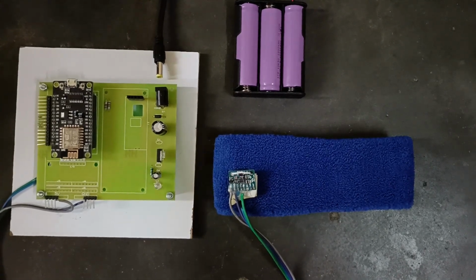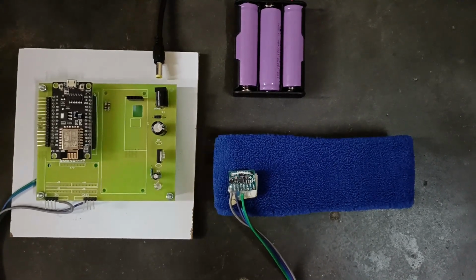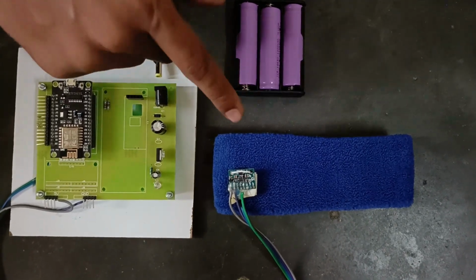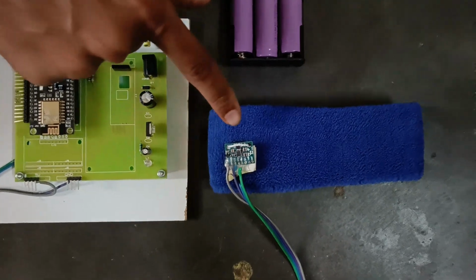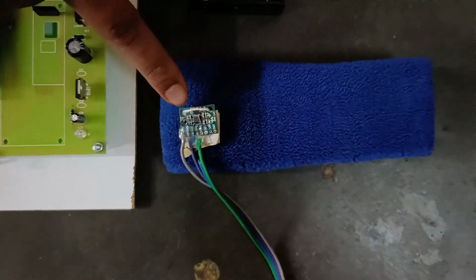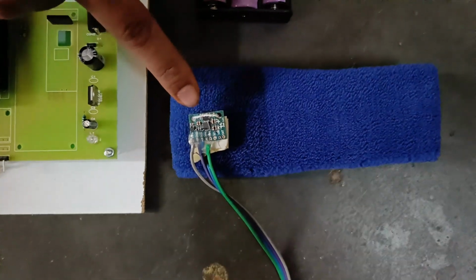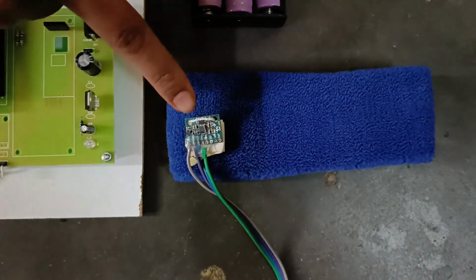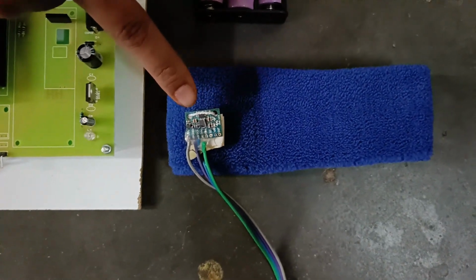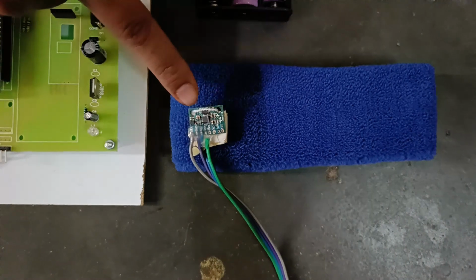Our project consists of two main components: the transmitting section and the receiving section. In the transmitting section, let's look at the first part, the accelerometer sensor. It is an MPU 6050 accelerometer which detects the angle in the three axes, that means X, Y, Z. Within a second, it can detect up to 100 values.